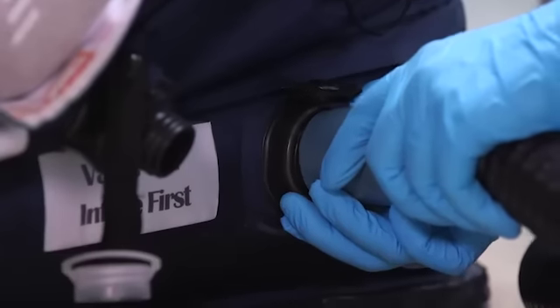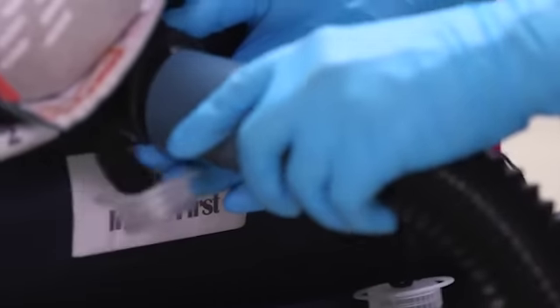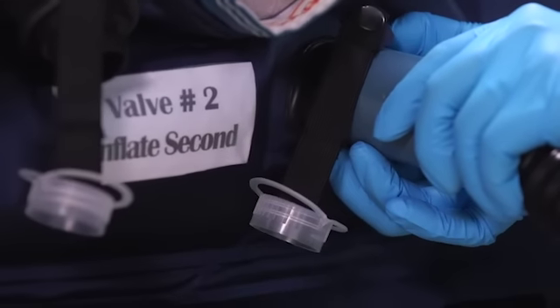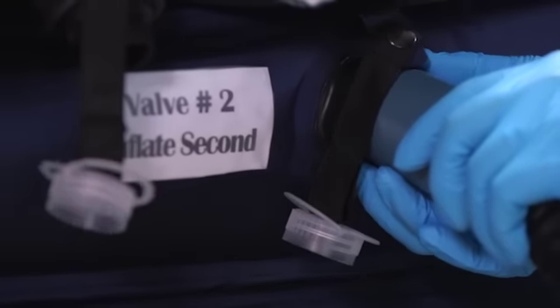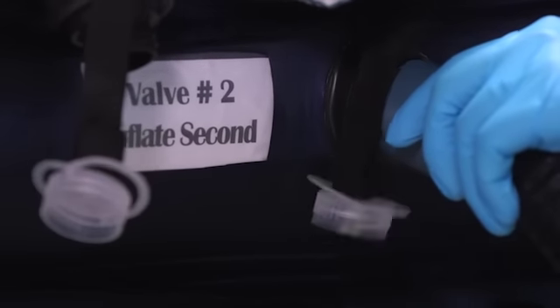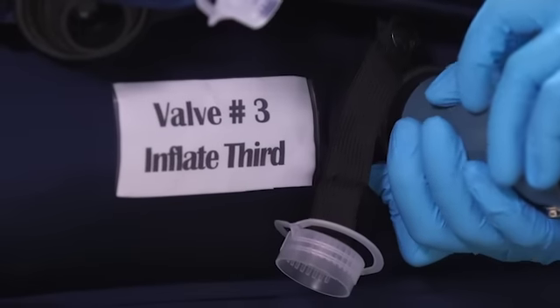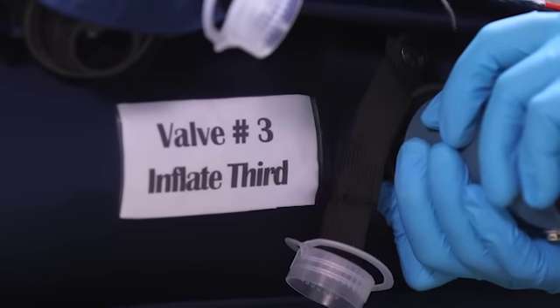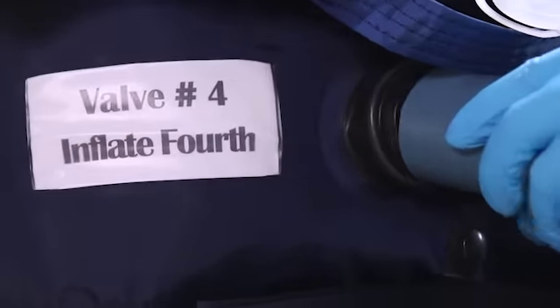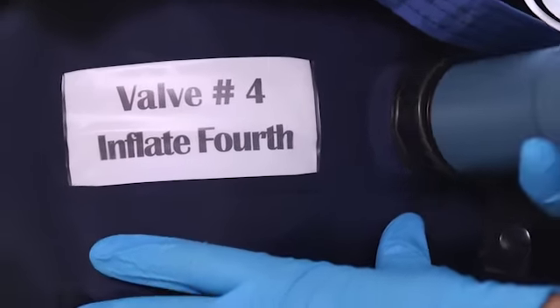When you have determined that the first chamber is fully inflated, move the air hose to the valve in the second chamber, labeled Valve 2, and repeat the look, listen, and feel technique until fully inflated. Continue the same process for air chamber valves labeled 3 and 4. It is important that each chamber is inflated in sequence for safety, starting with the chamber valve 1, which is closest to the floor. If chambers are inflated out of order, the HoverJack can become unstable.